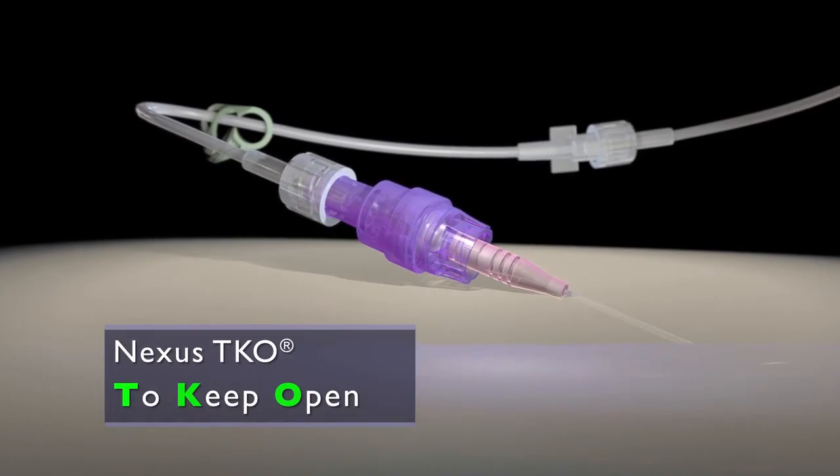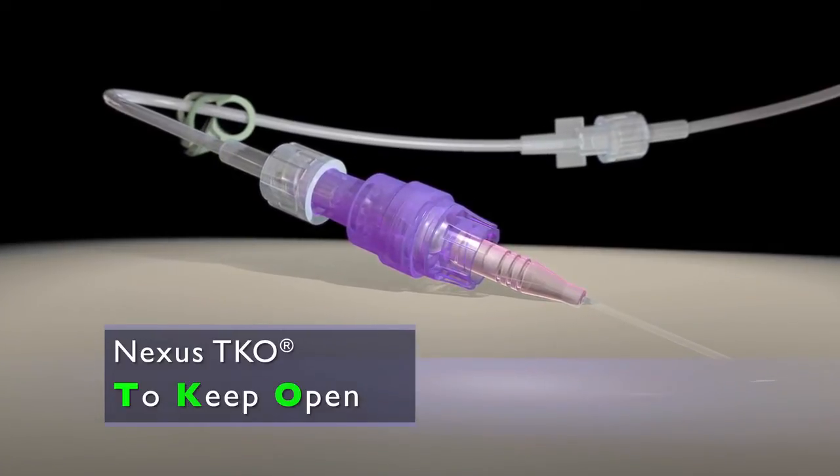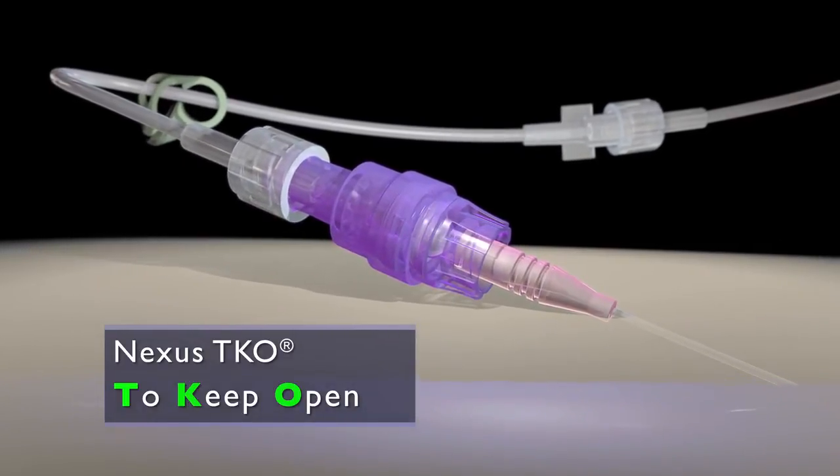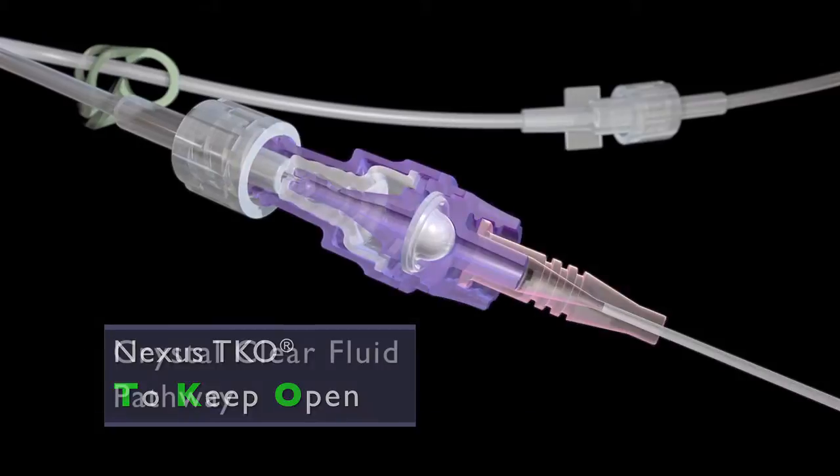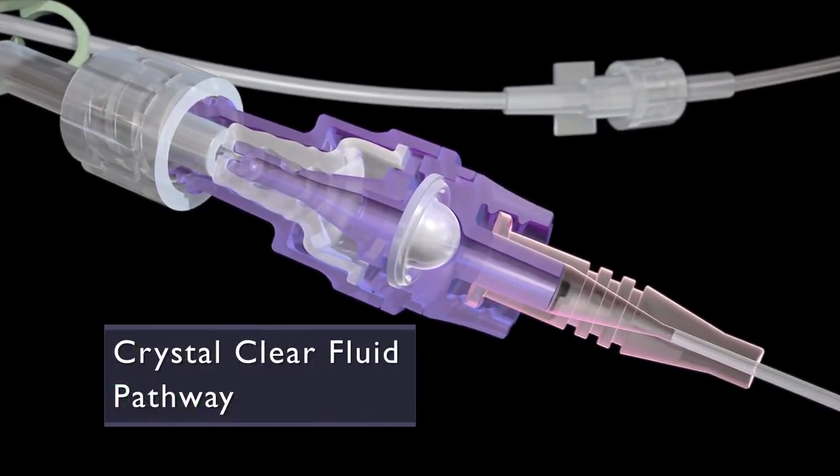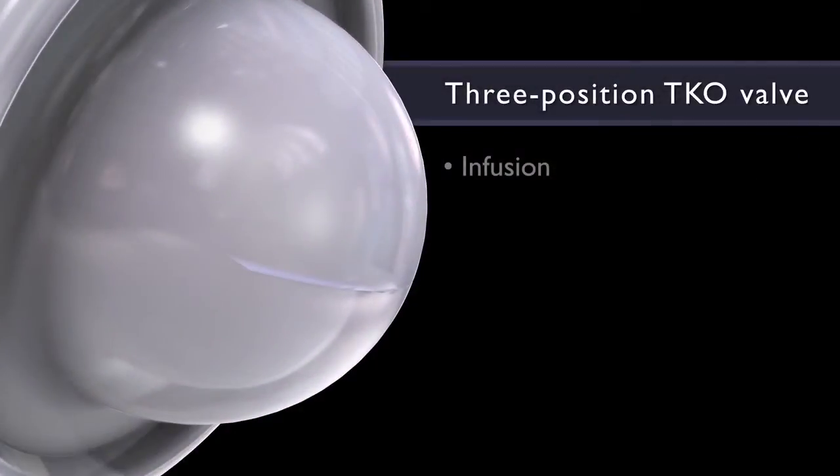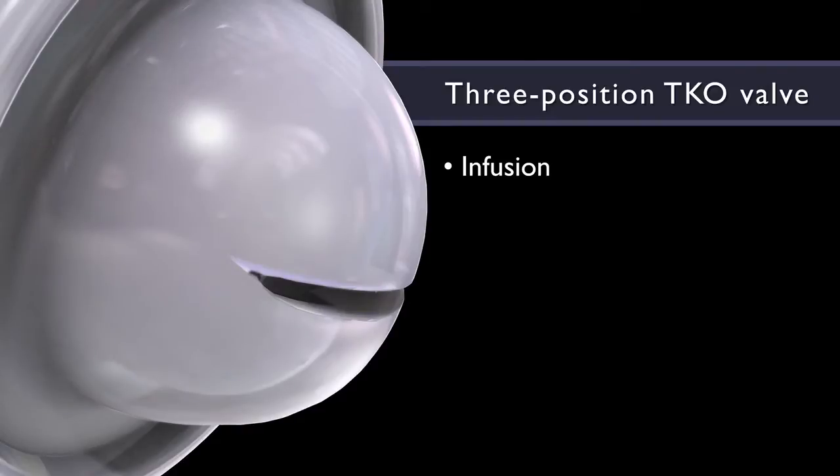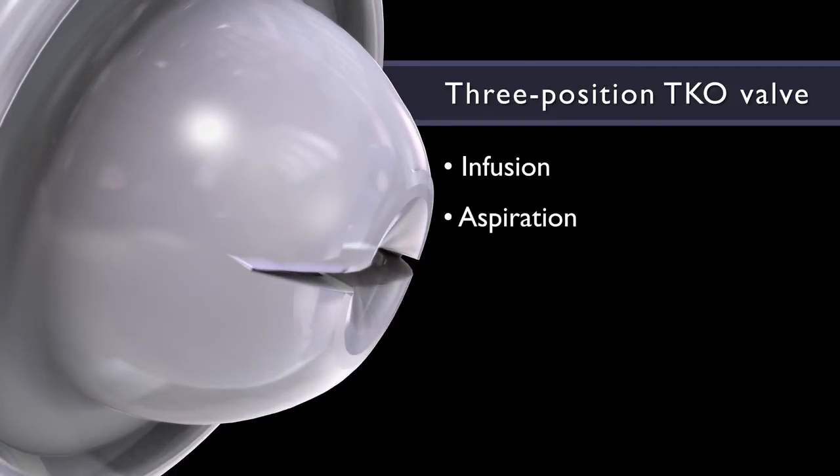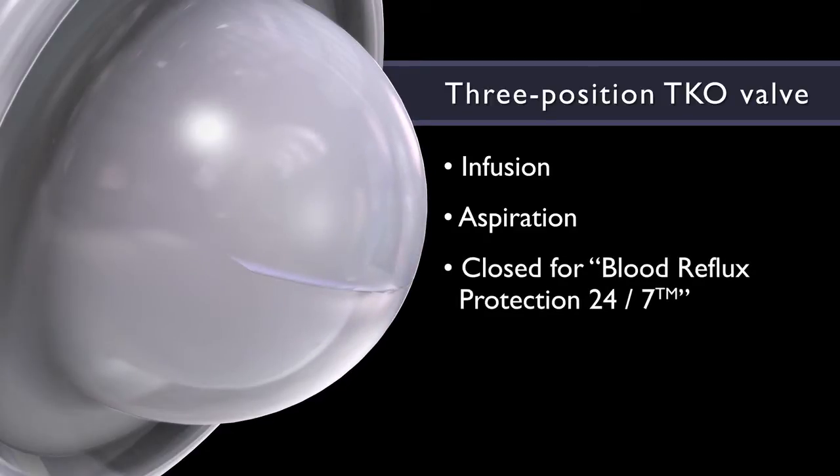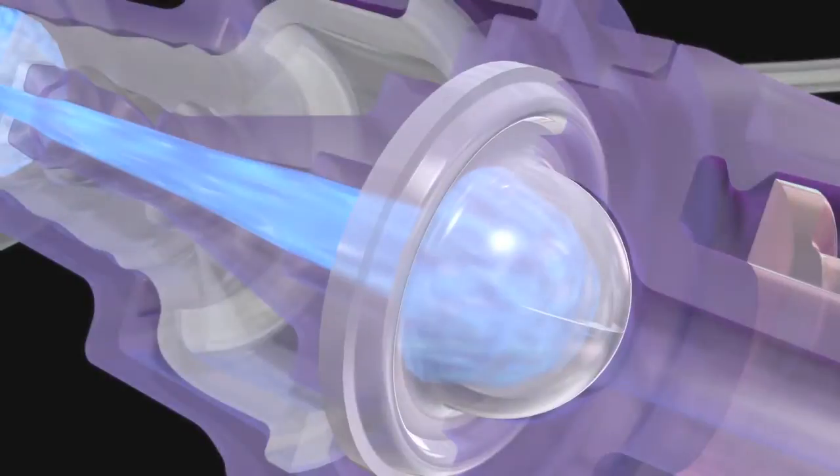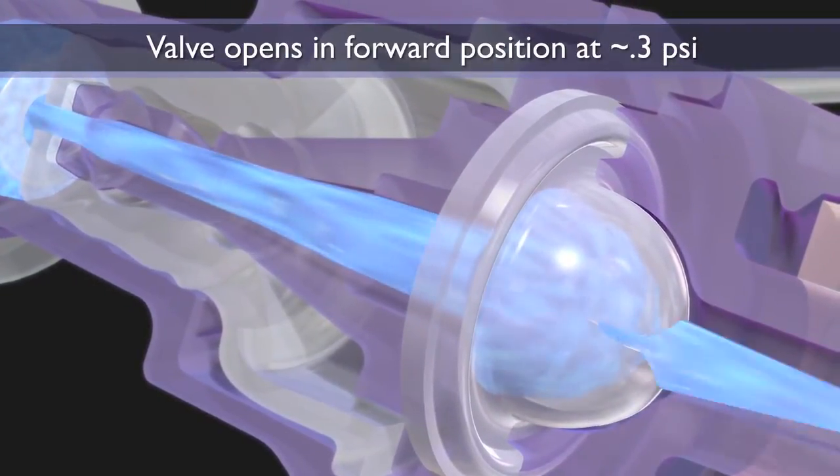Nexus TKO anti-reflux technology simplifies the complexity of IV therapy by maintaining IV catheter patency. The three-position, pressure-activated TKO valve was designed to reduce catheter occlusions by preventing unintentional blood reflux. The crystal-clear TKO valve opens in the forward position for infusion and opens in the reverse position for aspiration.